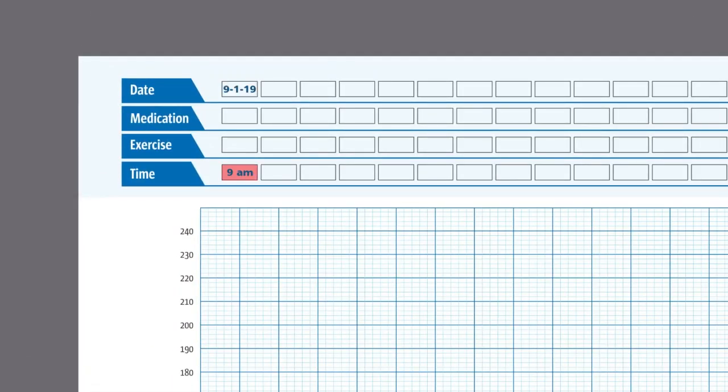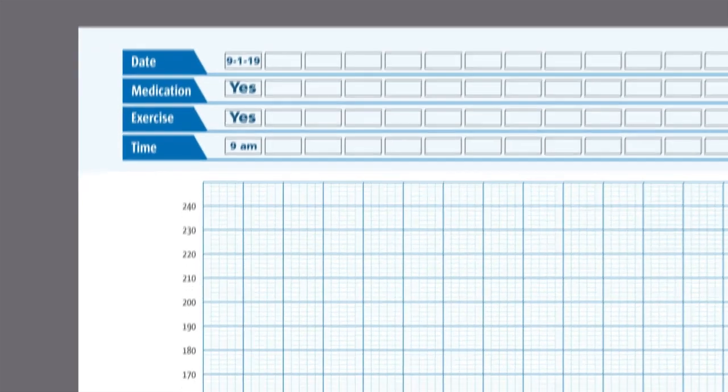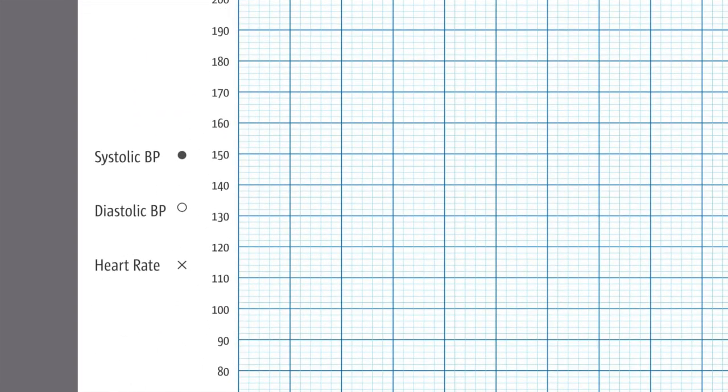Mark YES if you have taken your medication or performed any exercise before measuring blood pressure. Plot your systolic value as a dot, diastolic value as zero, and heart rate as X in the log sheet.